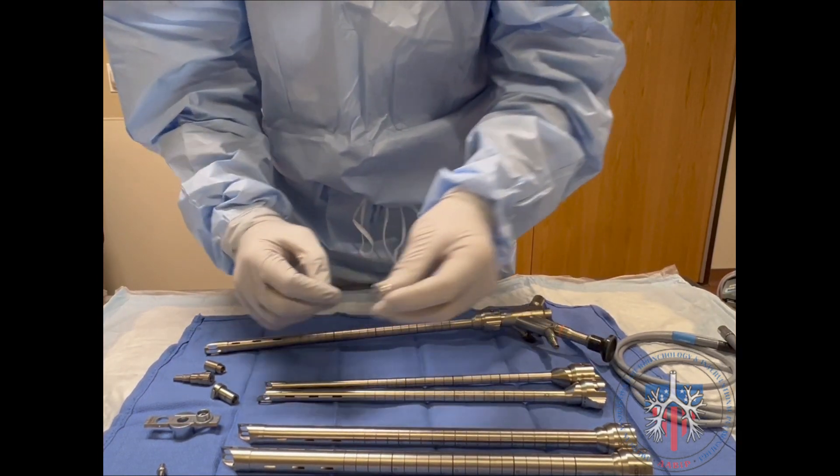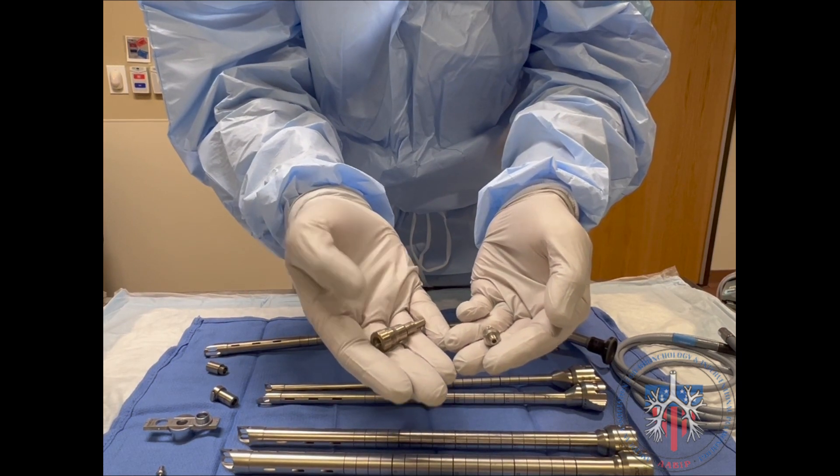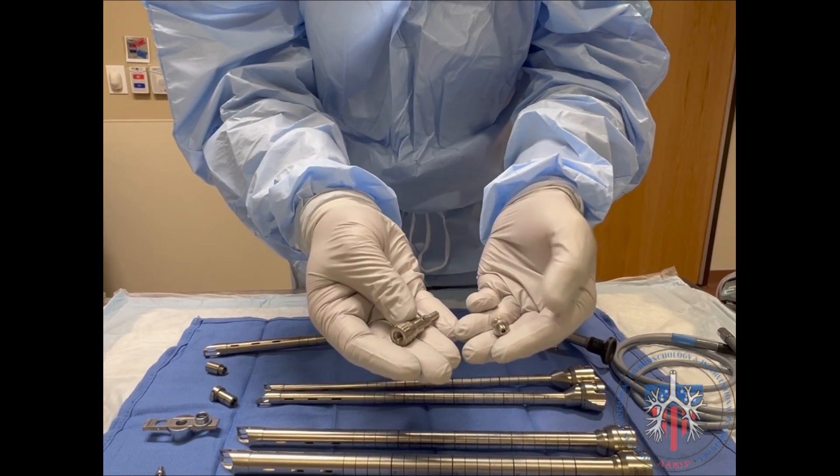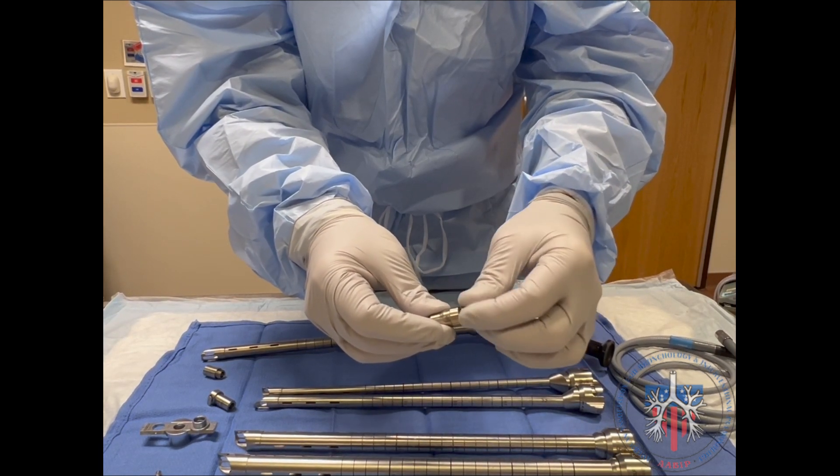To prepare for jet ventilation, the jet ventilation adapter is connected to the luer lock adapter. This is then inserted into the bottom of the rigid scope and locked into place.